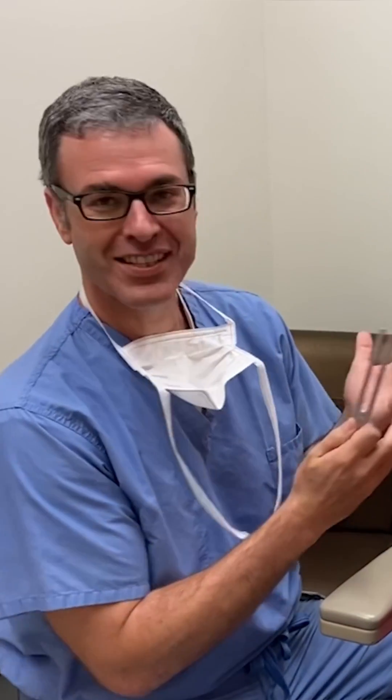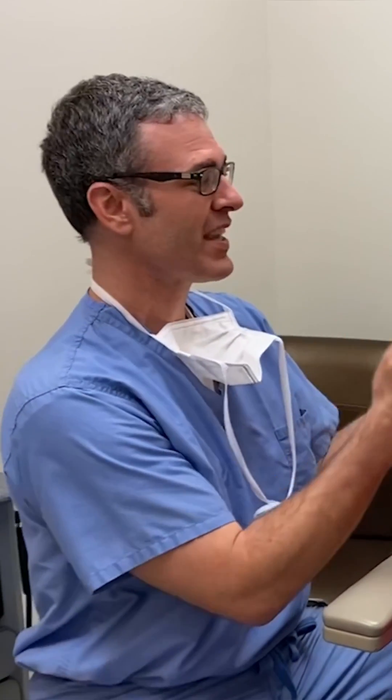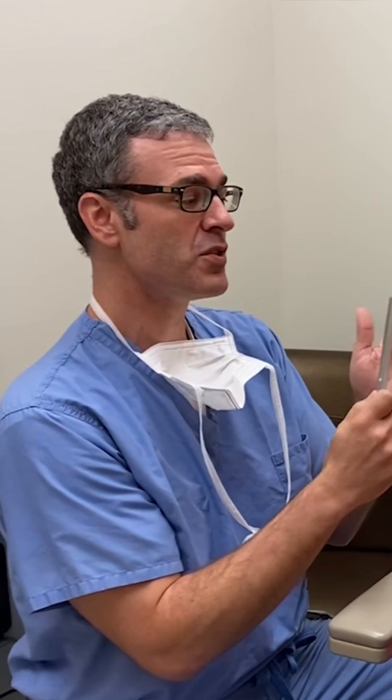This patient has volunteered to let us look at her eardrum and do the tuning fork test. She came in with right-sided ear pressure and right-sided pain, almost feeling like she was underwater, and she's got fluid behind her right eardrum.